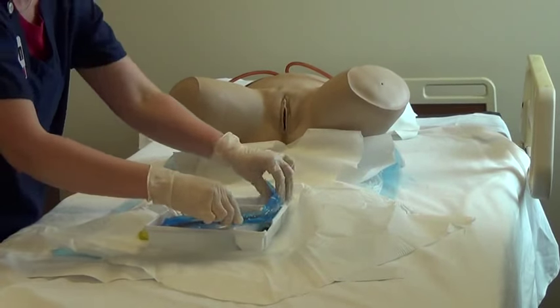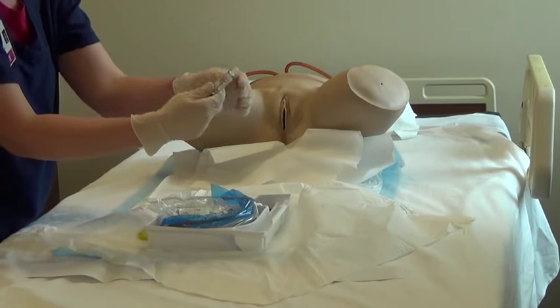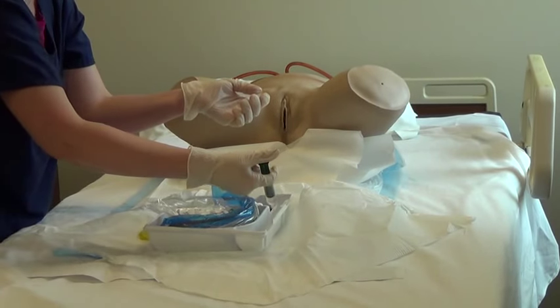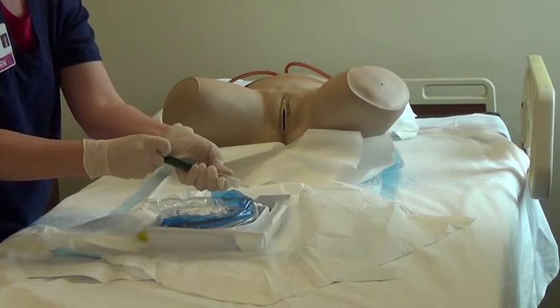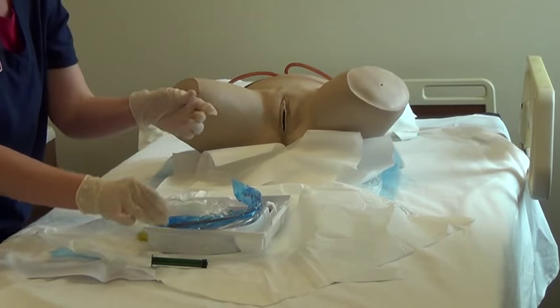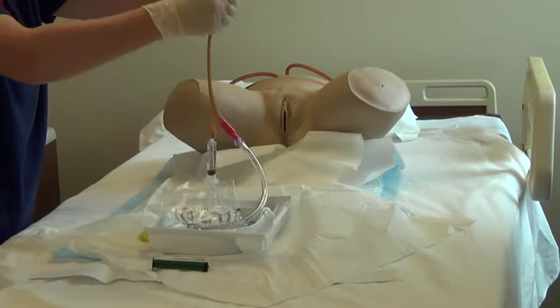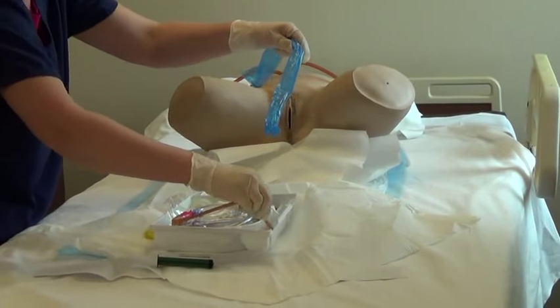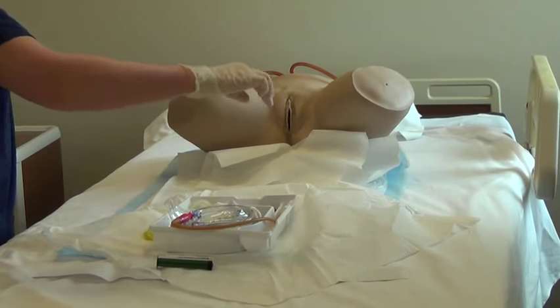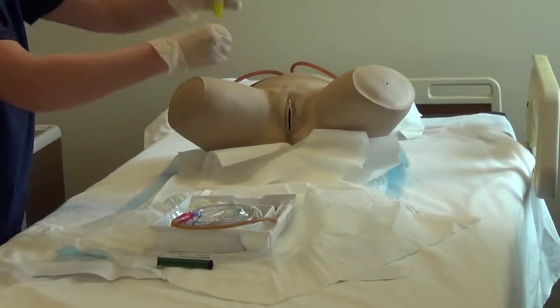Locate the green syringe with lubricant and deposit the full amount of lubricant into the tray. Do not put the catheter tip in the lubricant cap to avoid clogging the eyelet openings. Remove the Foley catheter from the blue wrap and place it into the lubricant. For male patients, connect the 2 pieces of the lidocaine Urijet and place it back onto the sterile field.